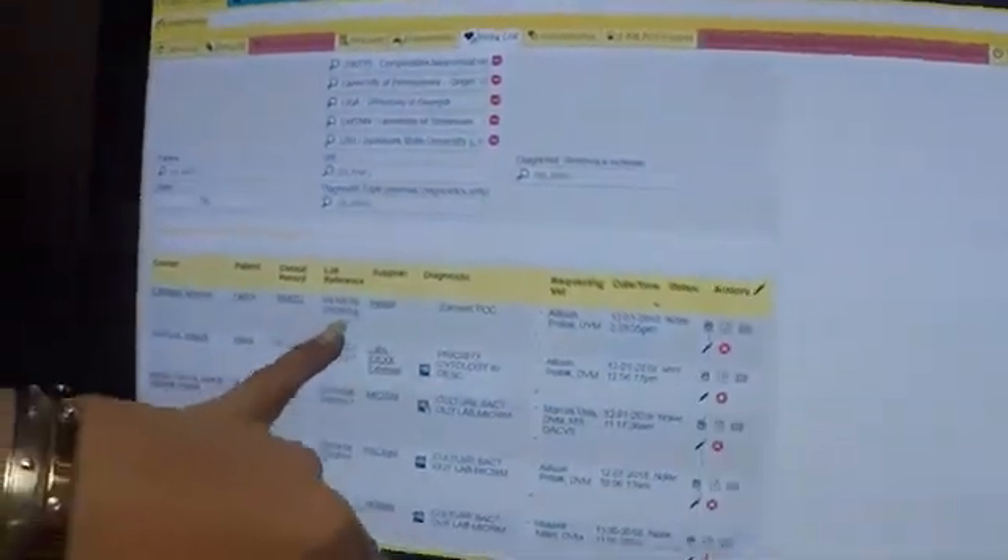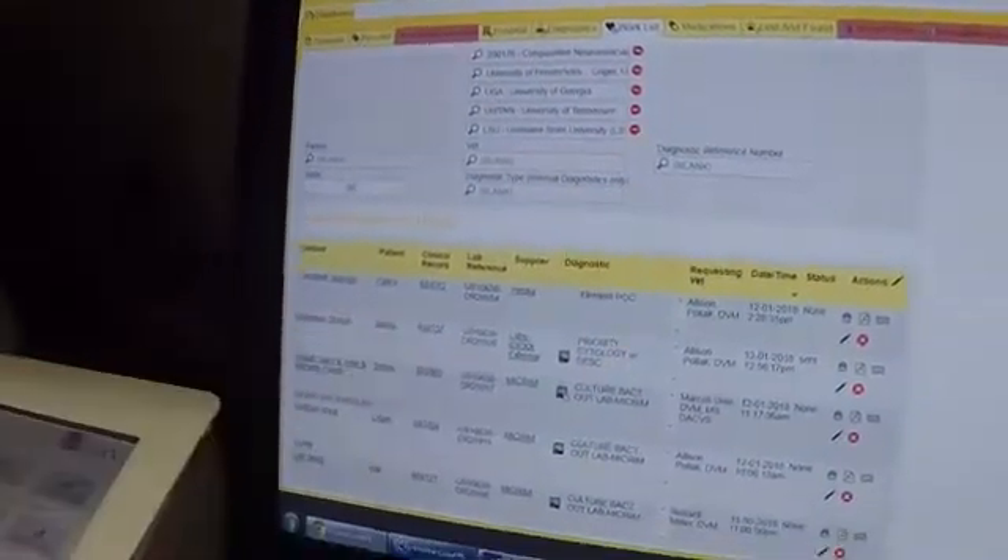Per usual, you're going to order your test through EZVET. You're going to use your DR number as your patient ID.